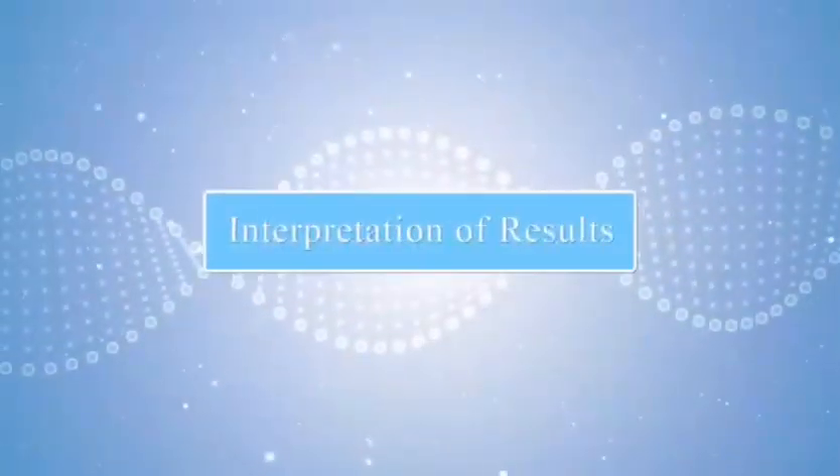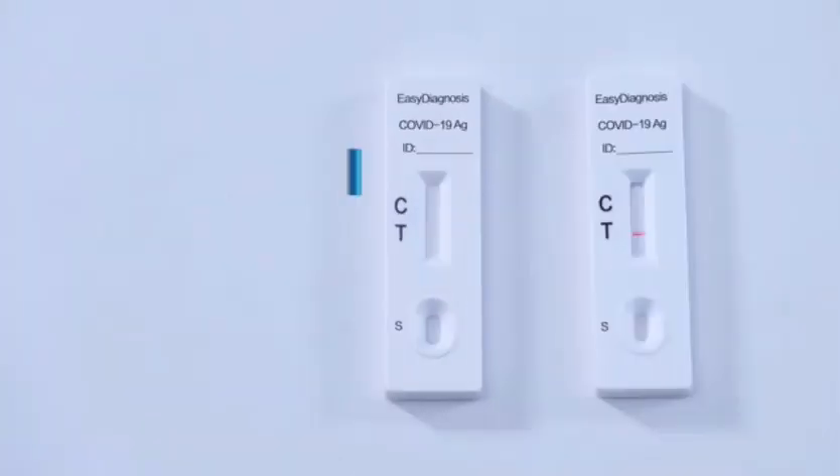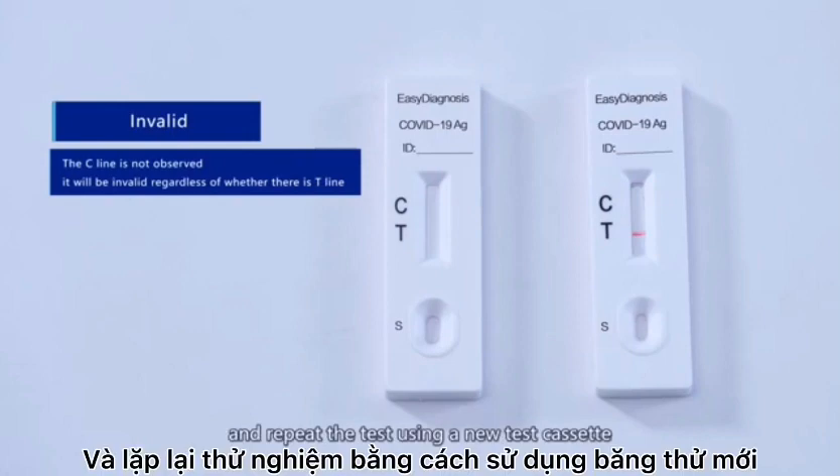Interpretation of results. Positive. Negative. Invalid — review the procedure and repeat the testing using a new test cassette.